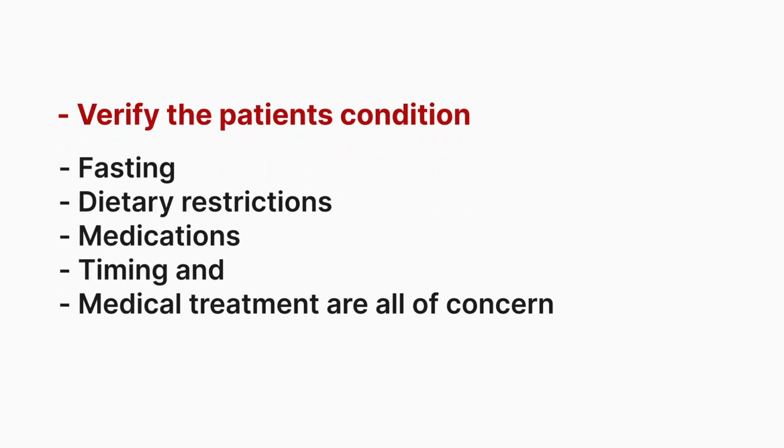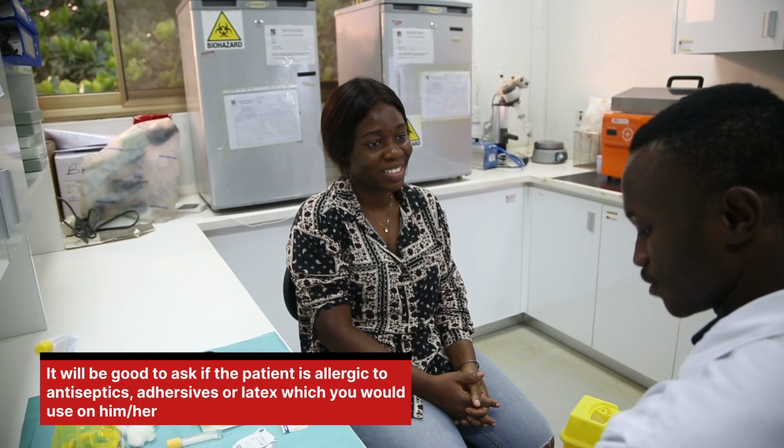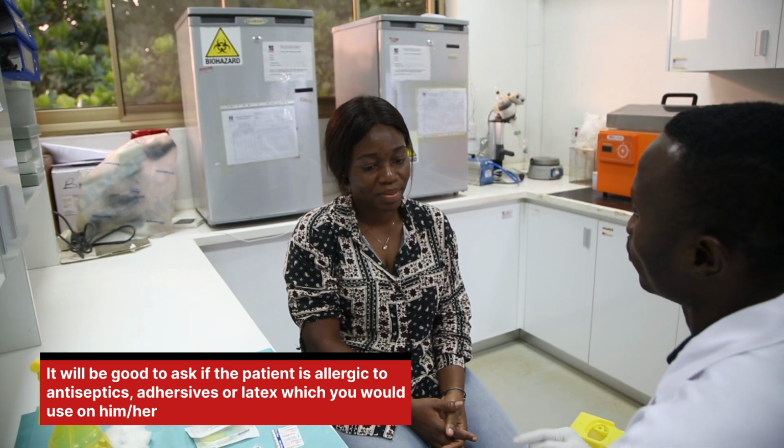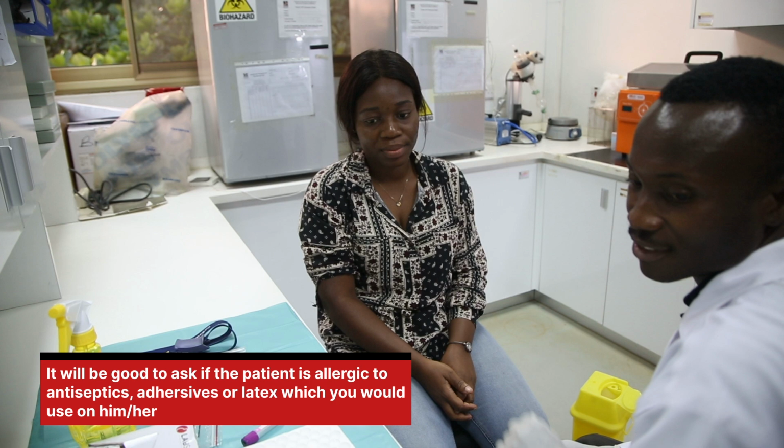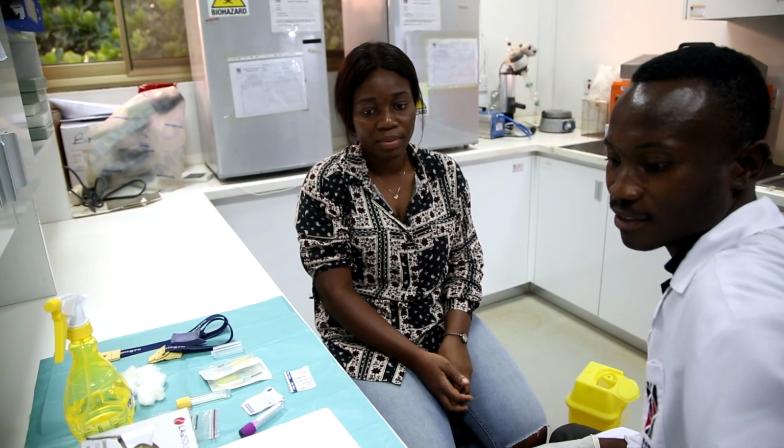Verify the patient's condition. Fasting, dietary restrictions, medications, timing, and medical treatment are of concern depending on the test to be done and should be noted on the lab requisition form. It will be good to ask the patient if he is allergic to any antiseptics, adhesives, or latex which you'll be using on him or her.